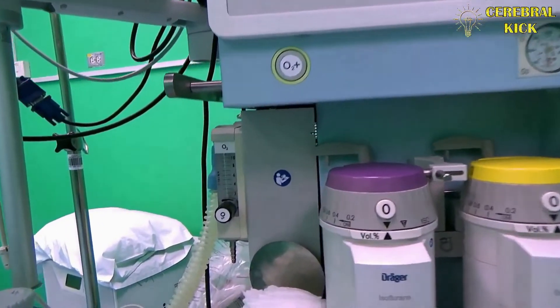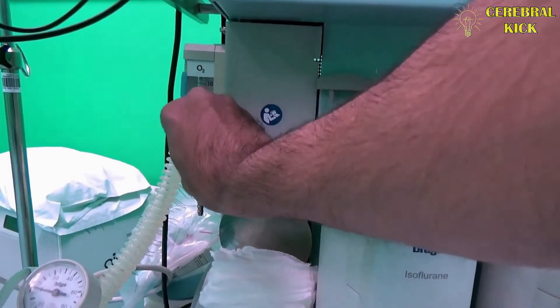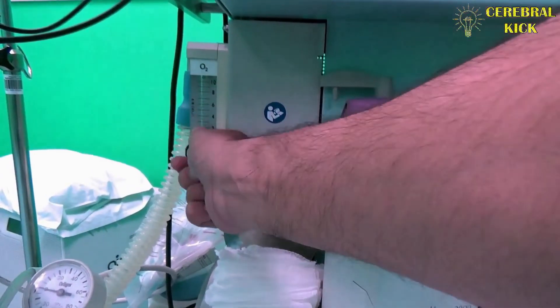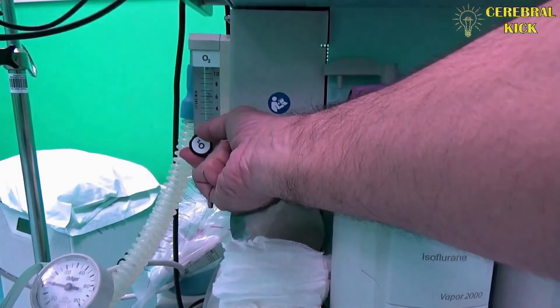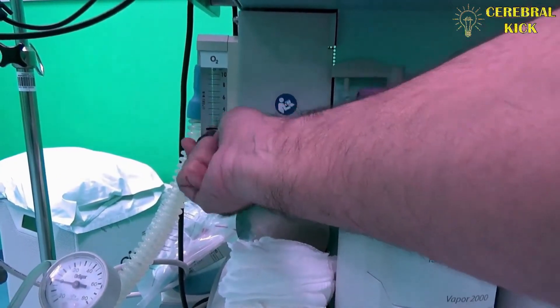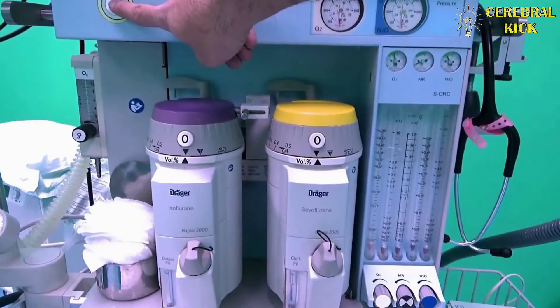You can see this is the auxiliary oxygen port. It can be used even when the machine is off because it has a direct connection, so it is free of electric power.